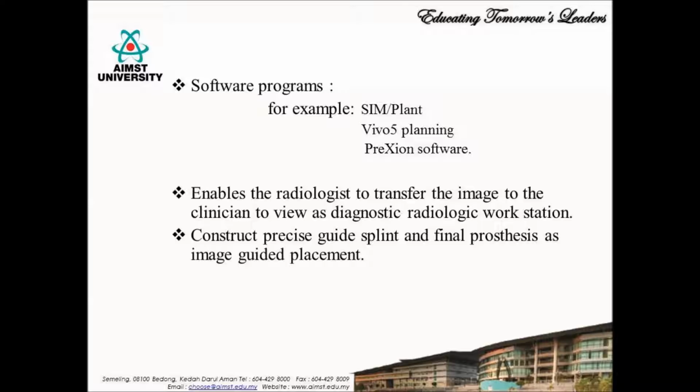These techniques enable the radiologist to transfer the imaging study to the clinician as computer files and enable the clinician to view and interact on their own computers as a diagnostic radiologic workstation. Some of the techniques have the ability to place the implant virtually and construct the precise guide splint and final prosthesis, which would be delivered after the implant placement following flapless surgery.